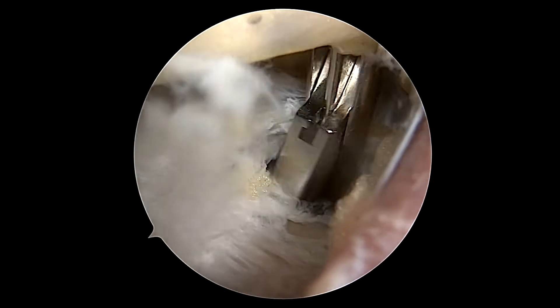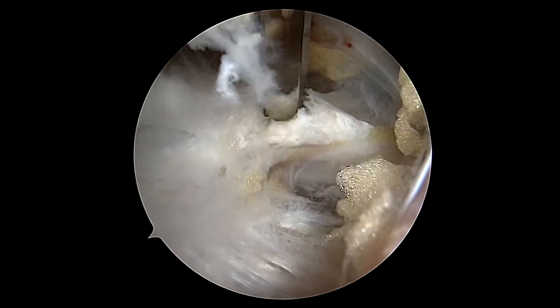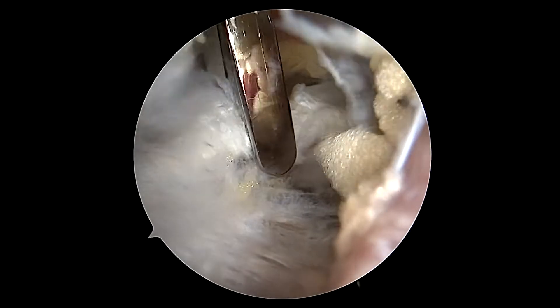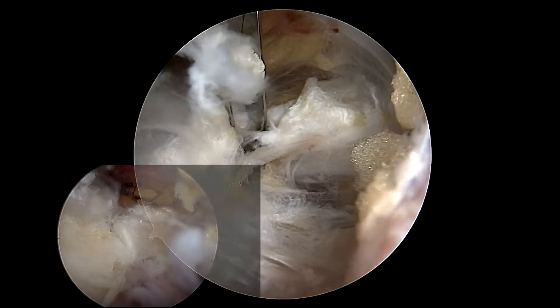I'm using a basket forceps or biter to bluntly open up an interval and taking very small bites to carefully release the ligament. I'm simultaneously retracting both the artery and the nerve out of the way.